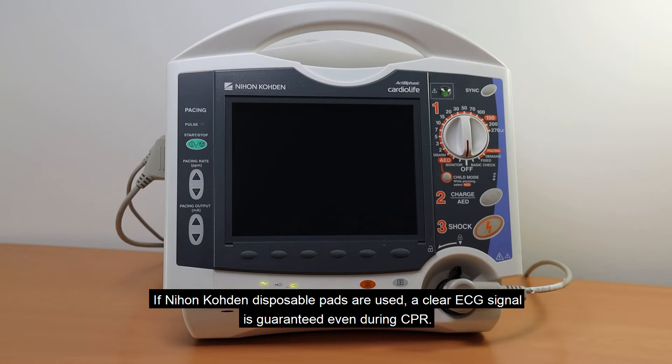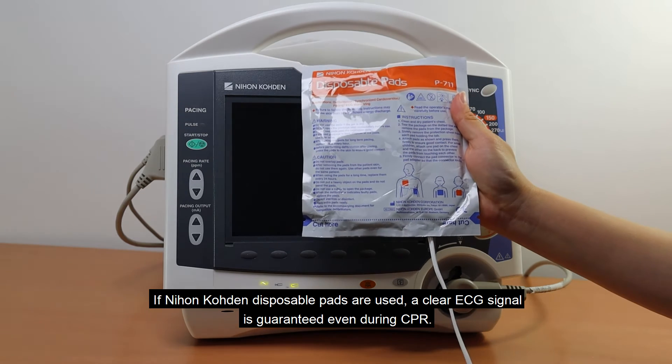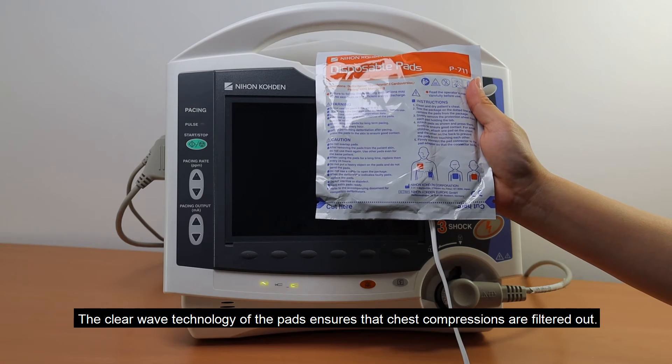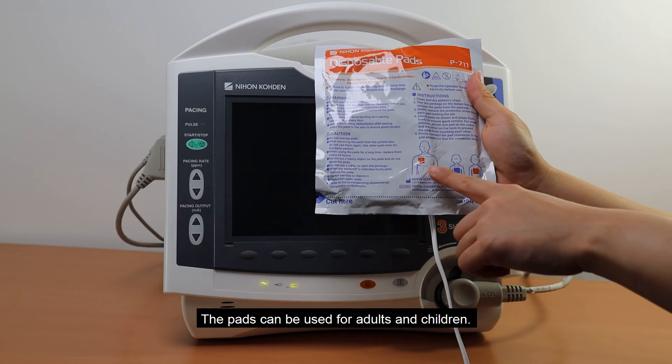If Nihon Kohden disposable pads are used, a clear ECG signal is warranted even during CPR. The clear wave technology of the pads ensures that the chest compressions are filtered out. The pads can be used for adults and children.